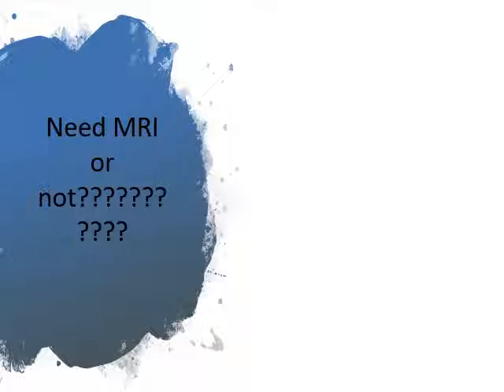But if the patient had an ischemic stroke, CT may be normal in the first few hours of the stroke. So the function of CT in this setting is to exclude hemorrhage and to give the possibility to diagnose the patient as ischemic stroke and start treatment like thrombolytic therapy or other interventional procedures.